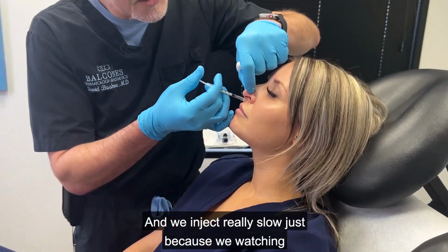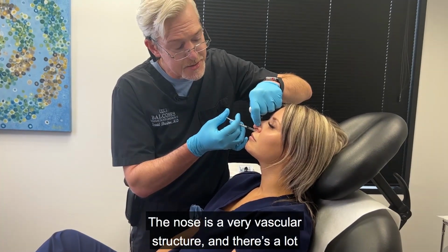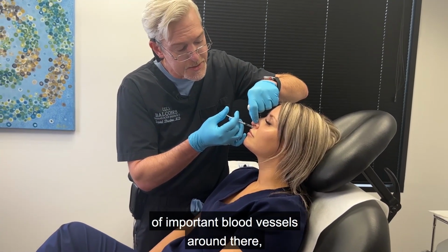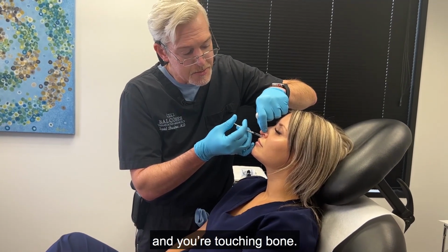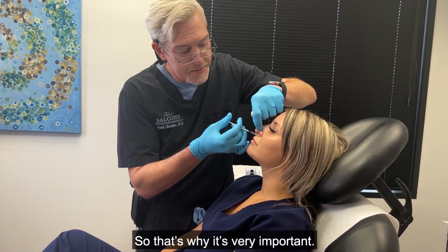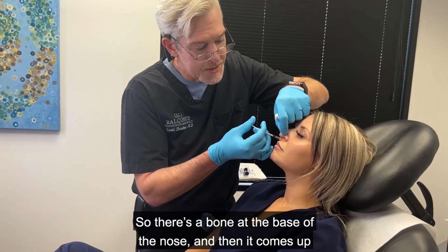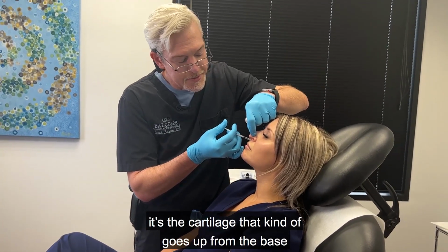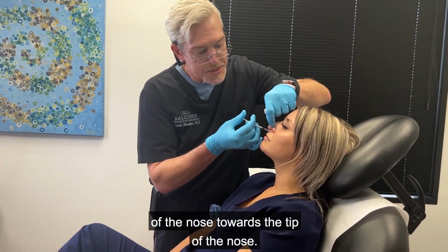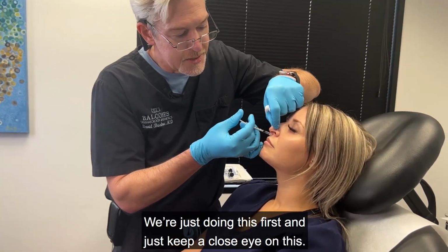And we inject really slow just because we're watching for anything important. The nose is a very vascular structure, and there's a lot of important blood vessels around there, and that's why you want to make sure you're at the base of the nose and you're touching bone. So that's why it's very important. There's a bone at the base of the nose, and then it comes up, and then it's called the columella. It's the cartilage that kind of goes up from the base of the nose towards the tip of the nose. But we're just doing this first, and just keep a close eye on this.